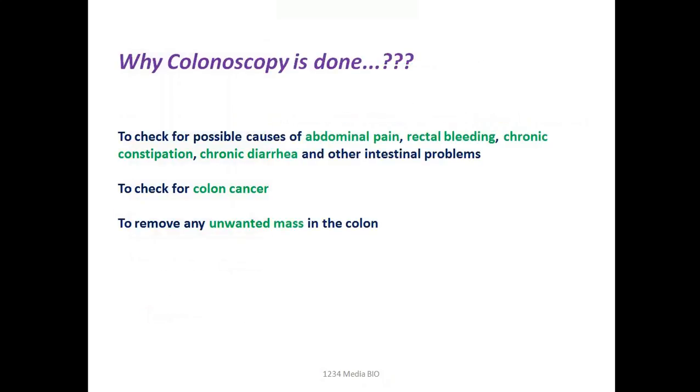So why is colonoscopy done? To check for possible causes of abdominal pain, rectal bleeding, chronic constipation, chronic diarrhea, and other intestinal problems, to check for colon cancer, and to remove any unwanted mass in the colon.